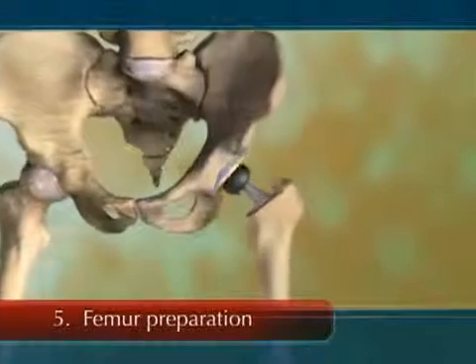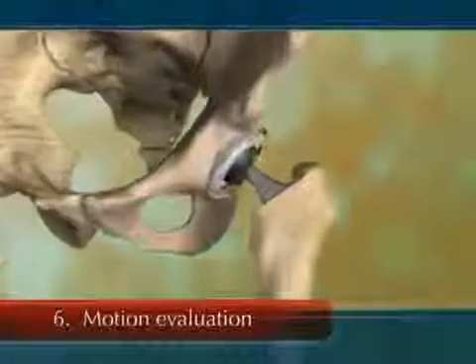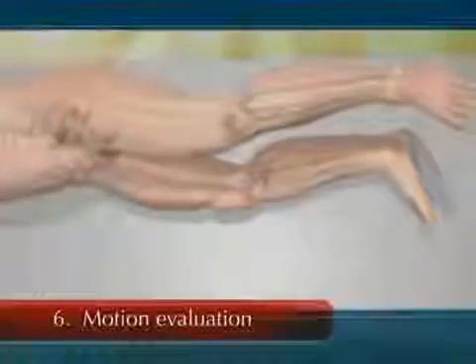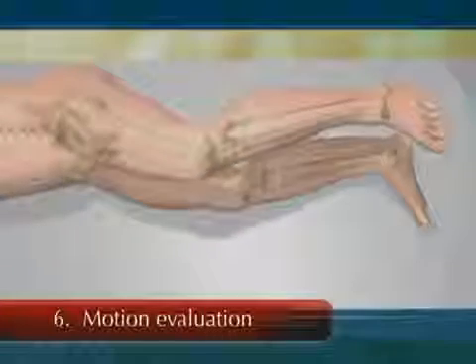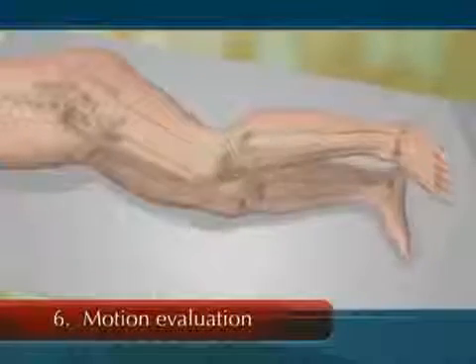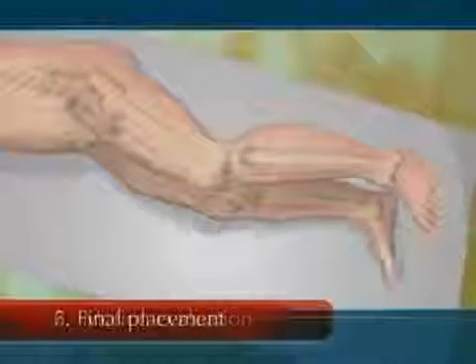The hip joint is then articulated by placing the ball in the artificial socket. The hip is evaluated for the type and amount of motion it has and the stability of the joint. That is, the inability of the ball to dislocate from the socket easily.